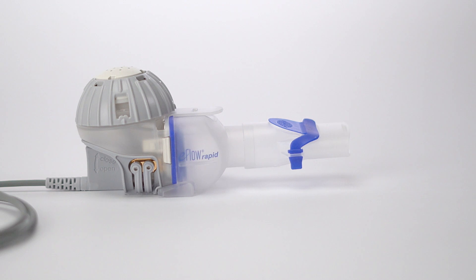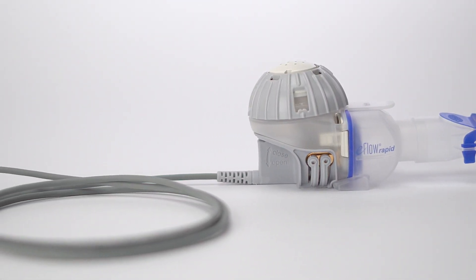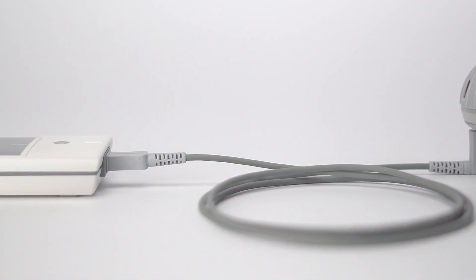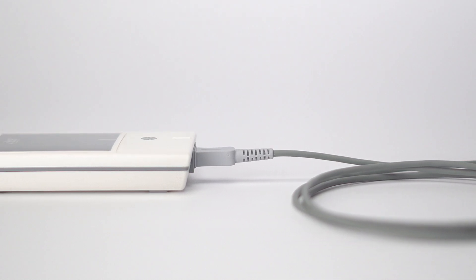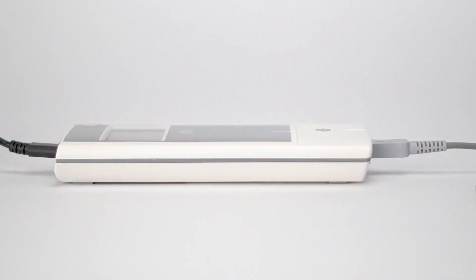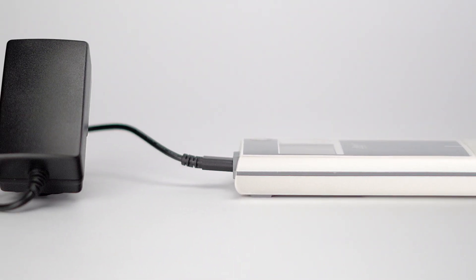For hygiene reasons, the eFlow Rapid Nebulizer handset and the connection cord must only be used by one person. For patients who are more susceptible to infection or who have a weakened immune system, it is recommended that the eBase controller and the power adapter are also only used by one person.